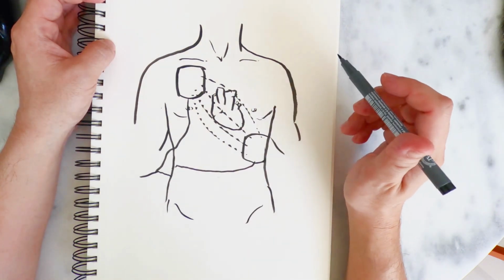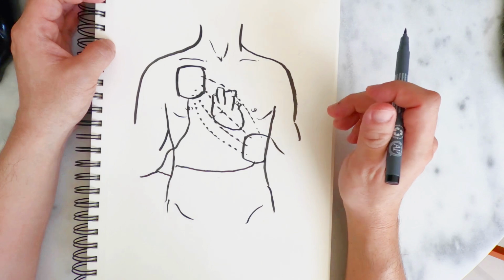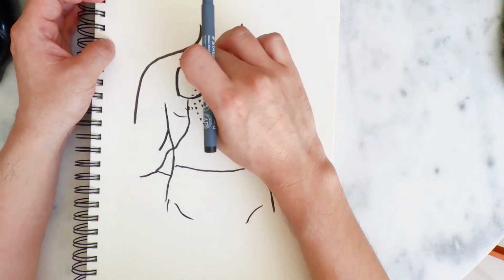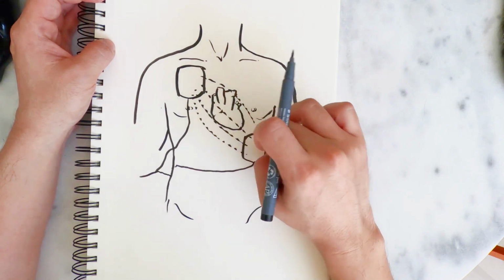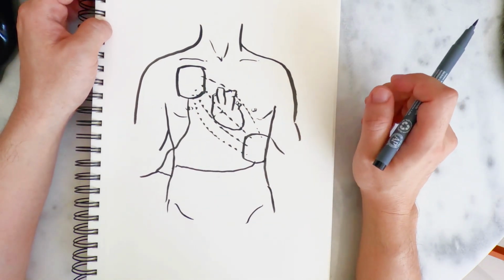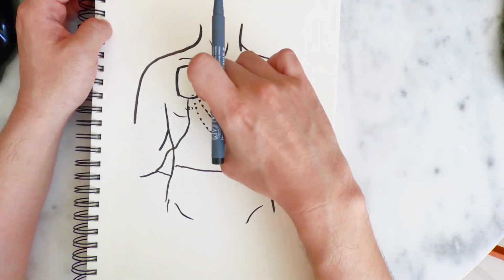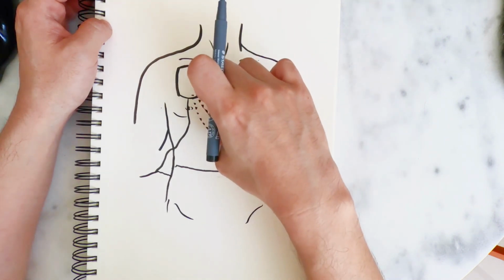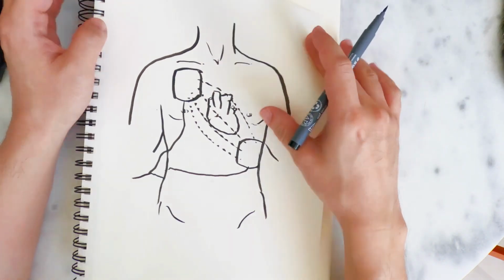In reality, there are other placement directions as well, which are found in research, such as placing pads on the front and back. They would use the right pad on the upper part and place it in the center of the chest, while the other pad on the left would be placed on the back. This method can be done, but it may need to be performed by a specialist doctor, as it is still at the research level. Next time, I will discuss this in more detail.